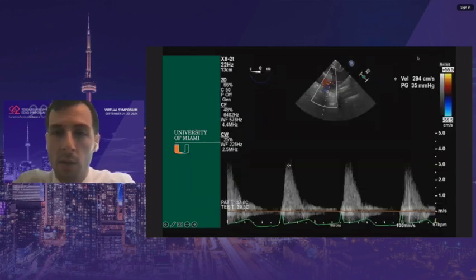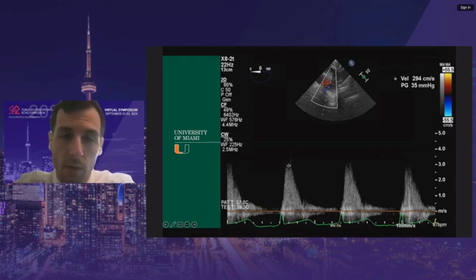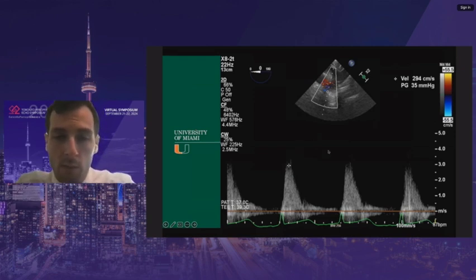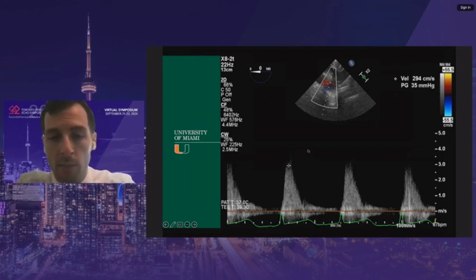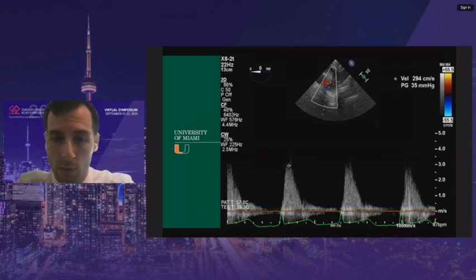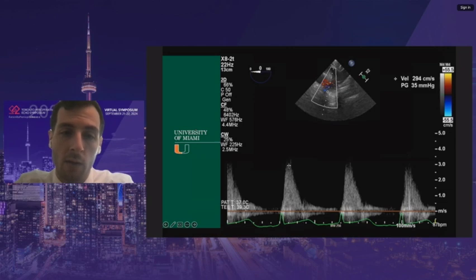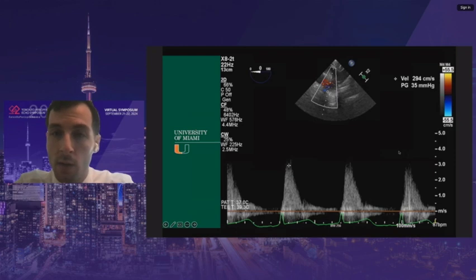Here's a similar case after chest closure following heart transplant. The peak gradient was 35 — it had been normal before chest closure. We told the surgeon, and he wasn't surprised: the donor pulmonary artery was a little short, and with chest closure it caused compression. They opened the chest back up and performed a PA plasty. This was an important finding made specifically because we reassessed after chest closure.